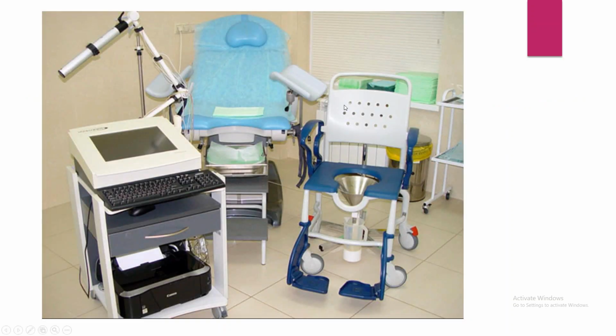So see, this is the urodynamics. This is the machine, or this is the setup for this urodynamic study. So can you see this chair? So this is a chair. Whenever the patient comes, first the patient is asked to sit on this chair and void. Okay. So for this, it requires privacy, because if the privacy is not provided, the patient may feel embarrassed and she may not void completely, or she may void intermittently.